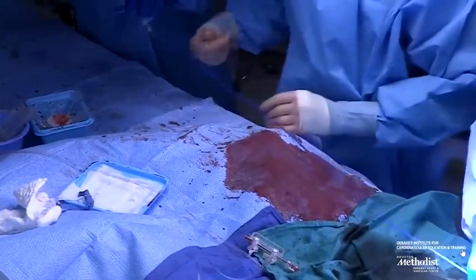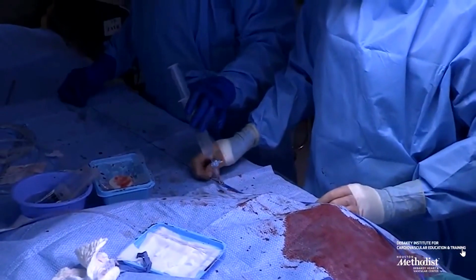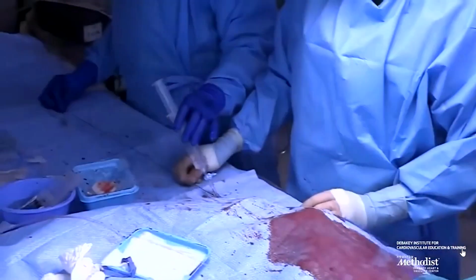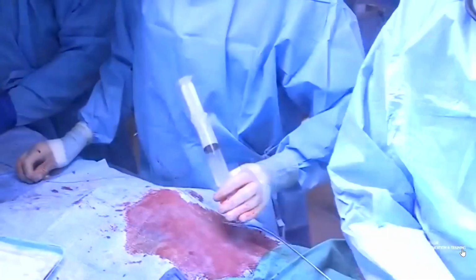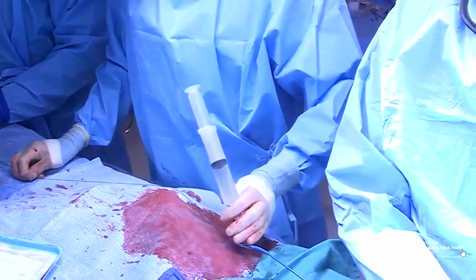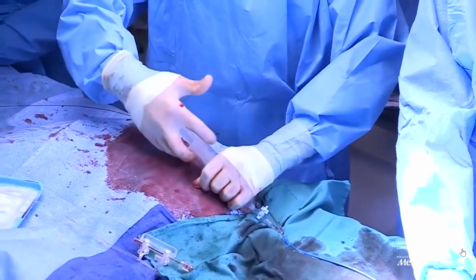Then you exchange that AL1 wire for a stiff wire that goes into the ventricle, now usually a Safari wire. Over that Safari wire, we put a balloon right across the aortic valve. We use that when there's a lot of calcium, when you have a bicuspid valve, and we need to pre-dilate that. That's us pre-dilating.